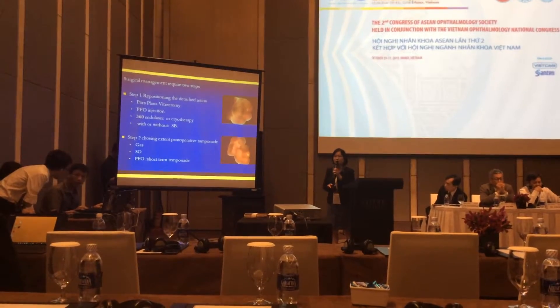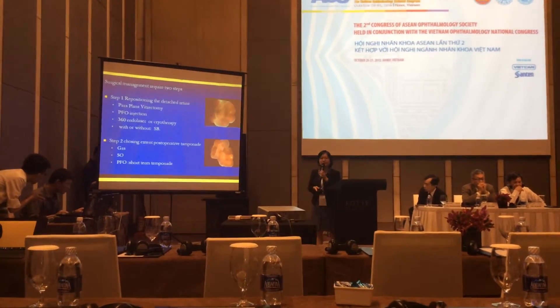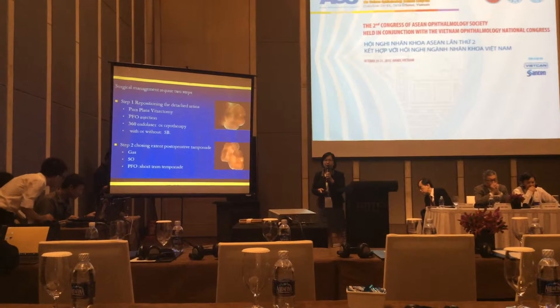Step one involves PFCL to unfold the retinal flap 360 degrees, followed by laser or cryotherapy, with or without a scleral buckle.